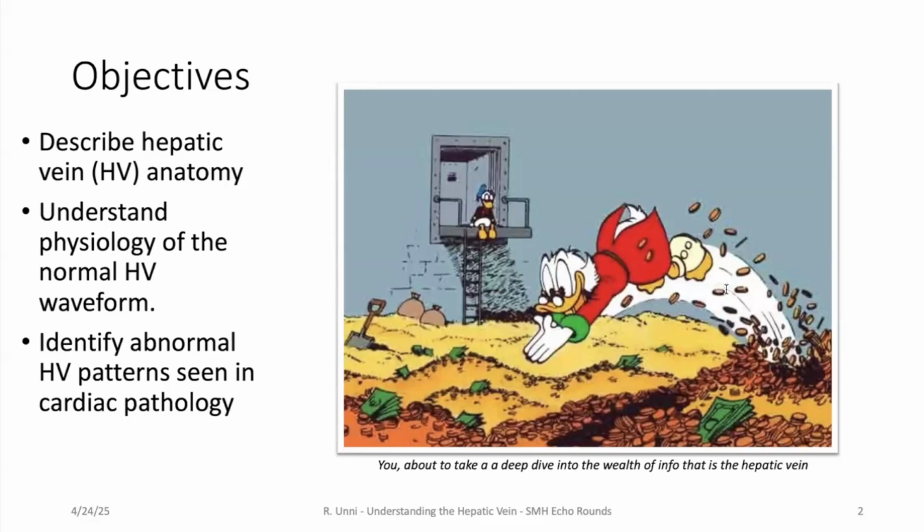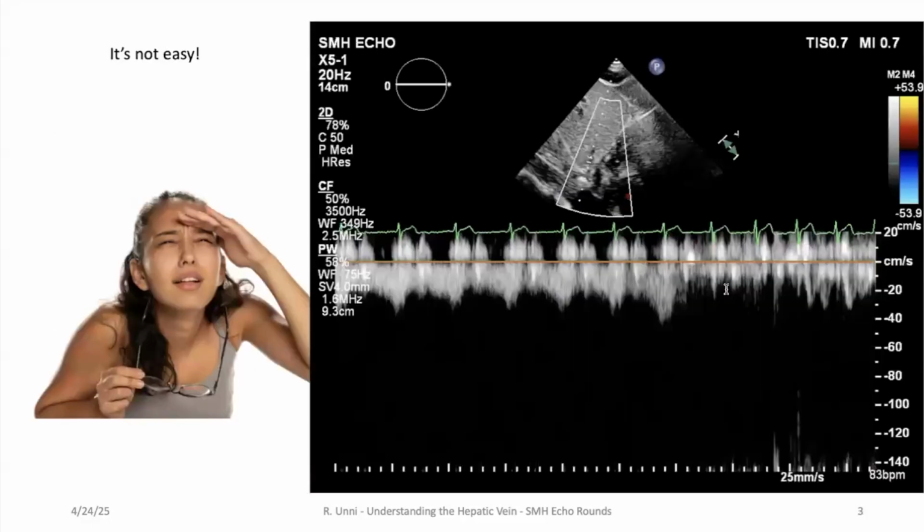It's been really interesting going into this very overlooked part of the standard transthoracic protocol. Hopefully, by covering just the basics, all of us will leave knowing way more about the hepatic vein than I did when I started. It's a very interesting topic, and so we are going to take a nice deep dive into the wealth of info that is the hepatic veins.